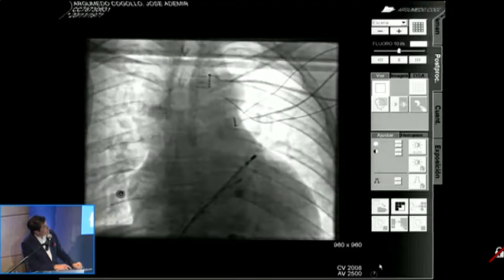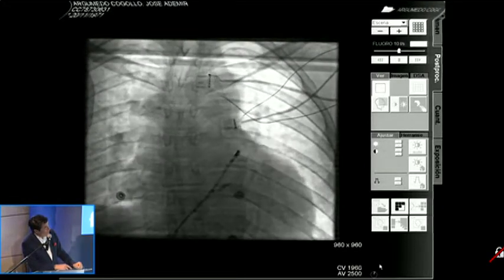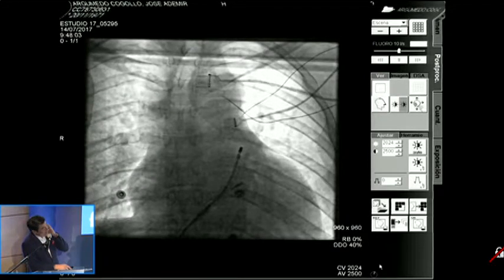The earliest point of the right cusp we want to see. Please show it to us and then we will connect with lab 3. Yes, we need to connect with lab 3. So please show us the activation from the right outflow tract for comparison.